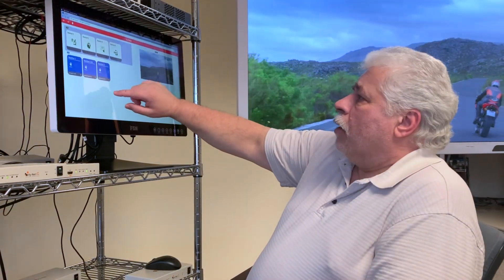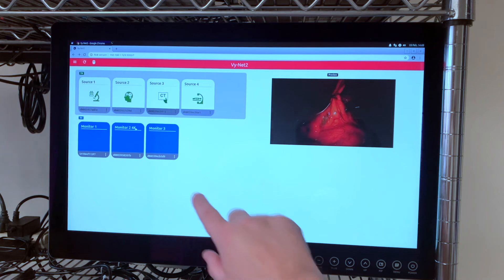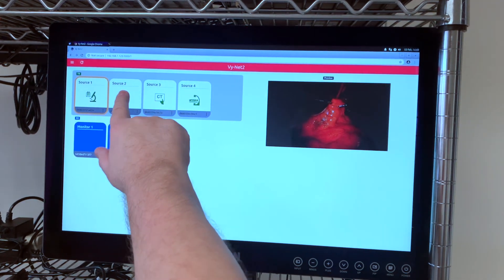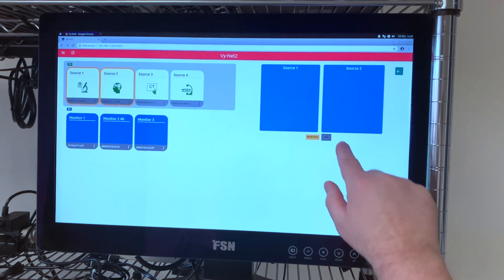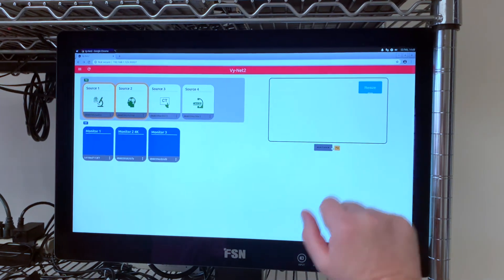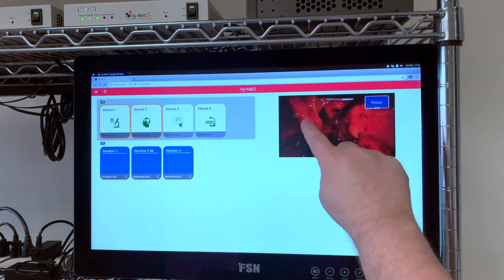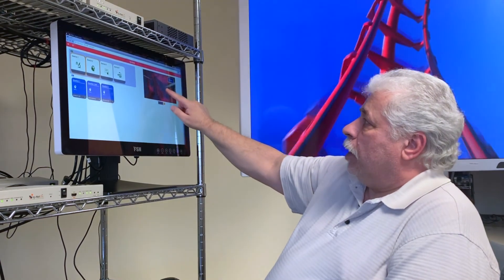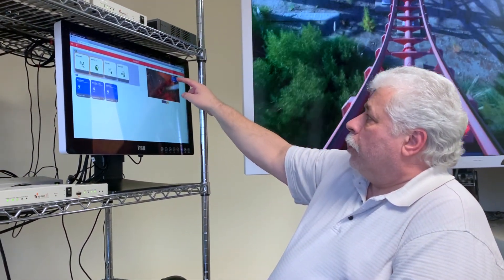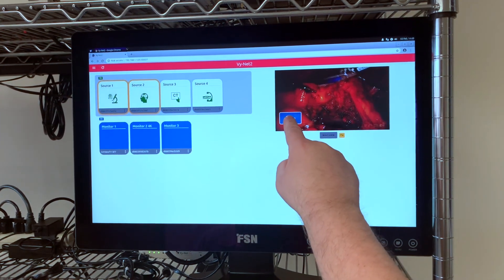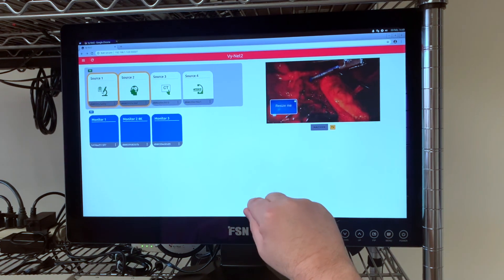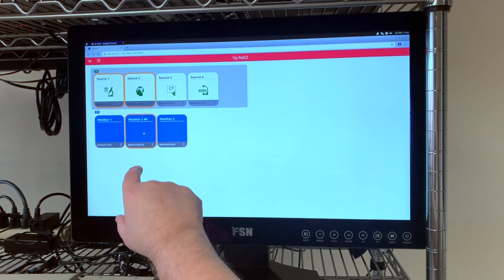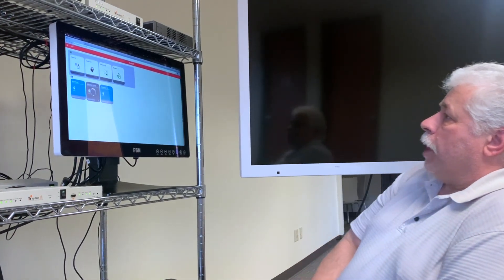Now we also have the ability to do picture-in-picture and multi-view. Simply select more than one source, we get a multi-view layout. If I touch PIP it turns into a PIP layout. The first source I selected will be the main screen. The second source I selected will be the PIP window. I can also move this PIP window and resize it. Once I've set my layout I can touch the output monitor and we should see that behind me.